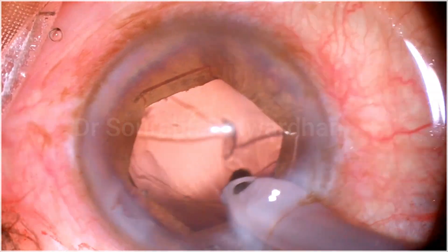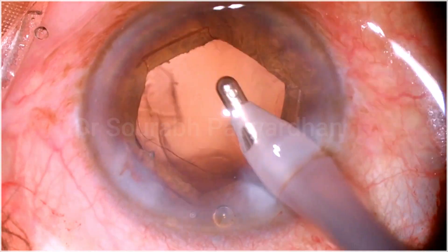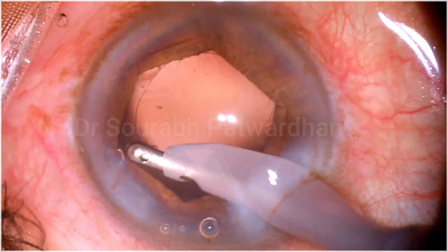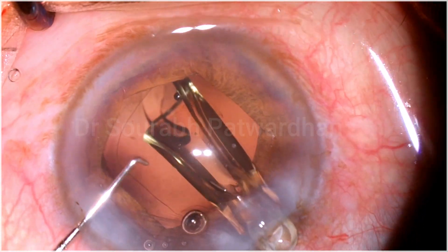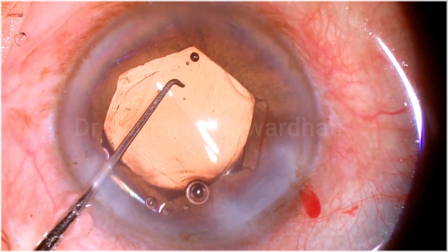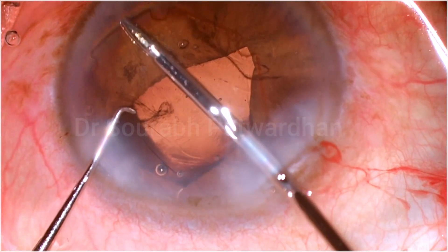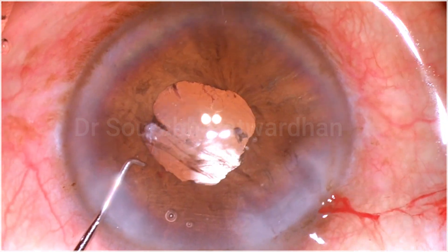You can see the iris is stuck in that side port. Very carefully I am removing the cortex — you have to be watchful of the anterior capsule margin because the AC was very shallow to begin with. These cases may have zonular weakness or elasticity as well, so you don't want to pull the bag. You have to watch the movement of the capsule margin whenever trying to aspirate the cortex, and not pull on the anterior capsular margin. During IOL insertion, you have to be mindful of the flange. I generally try to keep that flange under the iris so it doesn't get dragged when pushing the trailing haptic into the bag. Sometimes it gets dragged and you have to retrieve it carefully otherwise it may cause PC tear. Once IOL insertion is done, I am removing the B-Hex ring which is very easy. It's a uni-planar ring, very soft on the iris — you can use it under topical anesthesia with no problem.